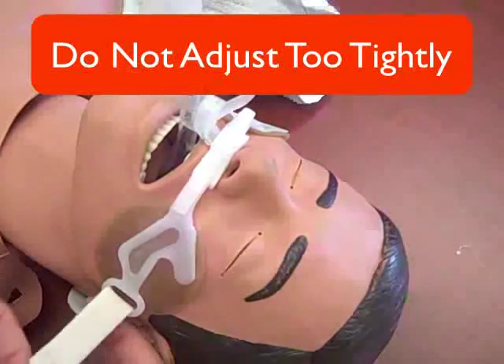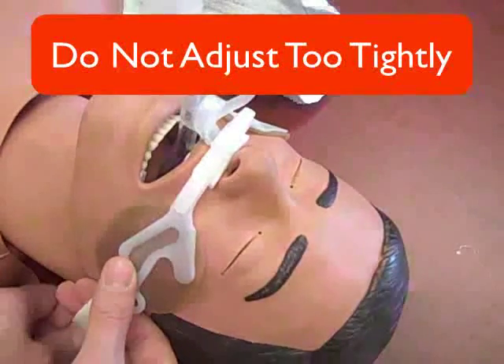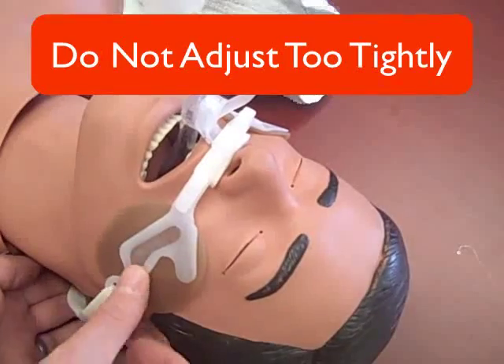When it is time to change the AnchorFast or to extubate the patient, pull back on the clamp to release. Make sure not to bend the clamp as it can break.